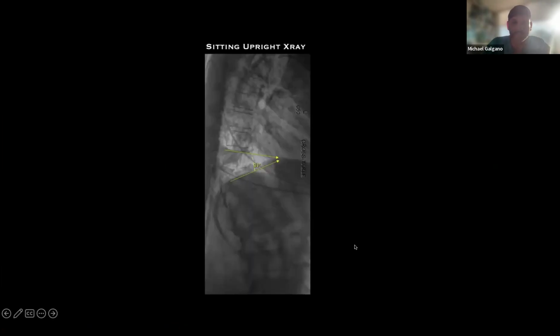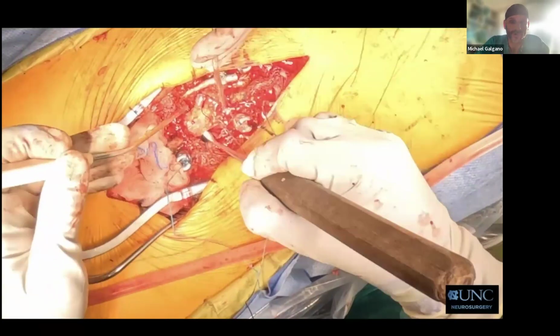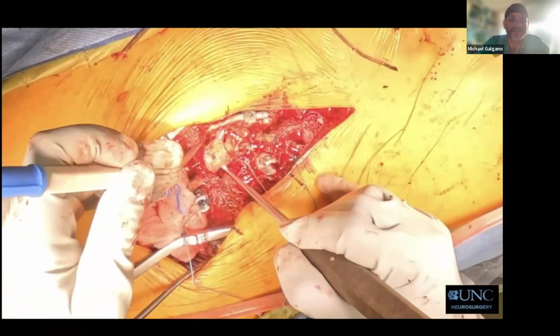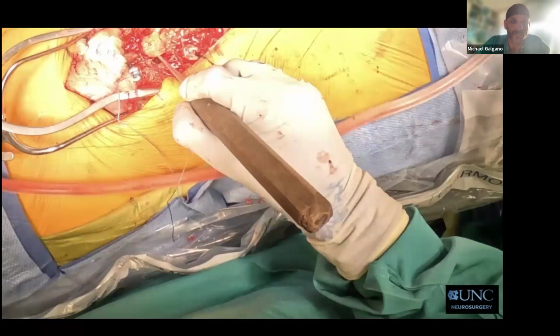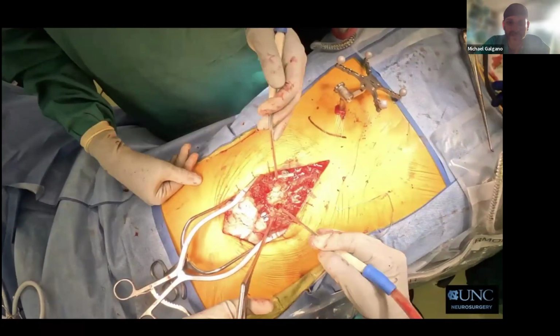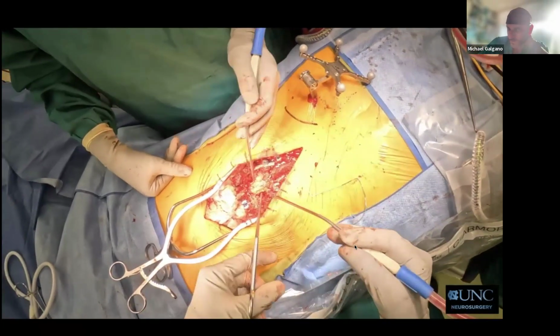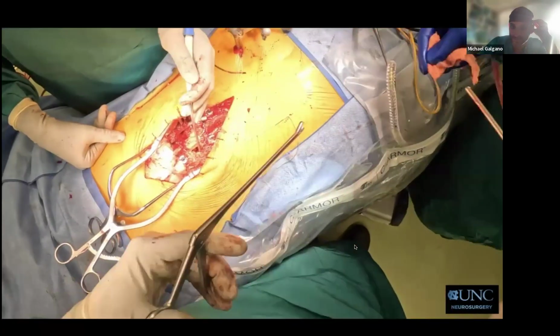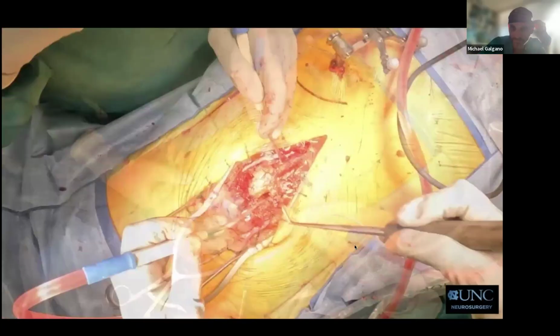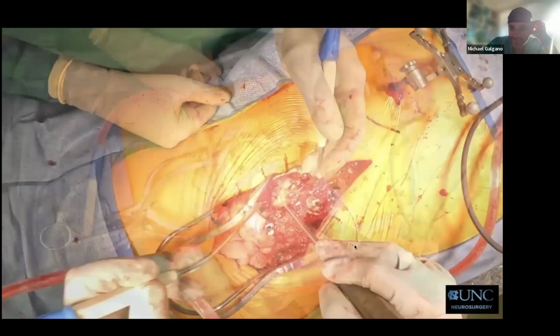It's obviously a surgical problem. So we decided to do a posterior VCR here. So, kind of jump straight to the good stuff, which is where we've placed our temporary rods on the contralateral side, and we've done our laminectomies, pediculectomy, facetectomies, and right now a partial corpectomy. We have an angled dissector that we're placing just ventral to the dura, and just like you would do a PSO, you have to make sure that you impact that posterior vertebral body wall, and that's essentially what we're doing here.